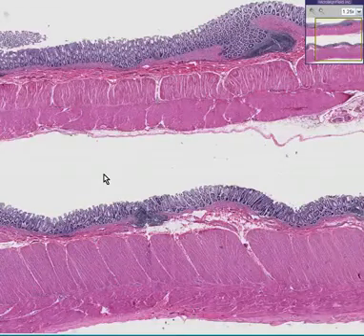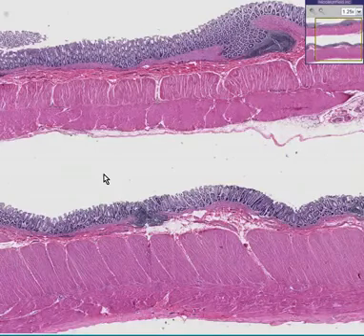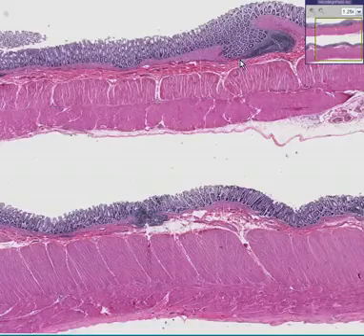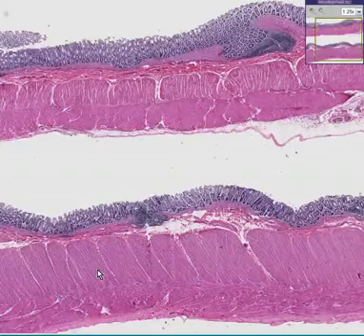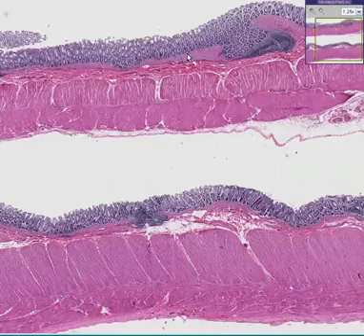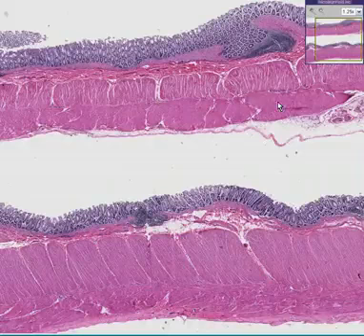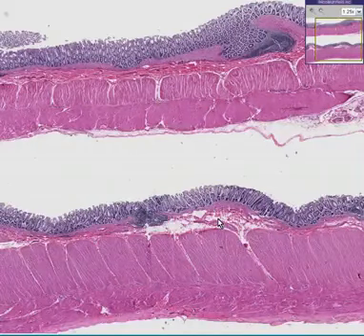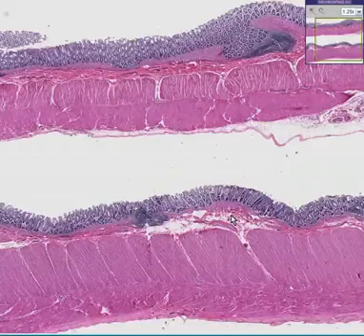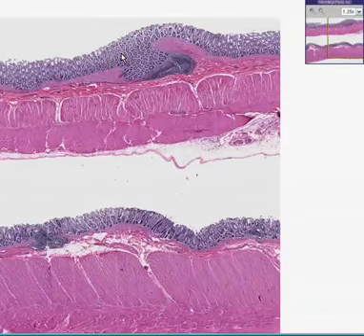I know you're thinking, why should I be showing you a normal large intestine? Well, if you look closely and go through all the classical normal histology of a colon, you can see a normal mucosa, a normal submucosa, a normal circular layer, a normal longitudinal layer, and so on. Some lymphoid follicles in the submucosa extending to the mucosa, normal glands, no inflammation, no neoplasm. So you'd think this is normal.